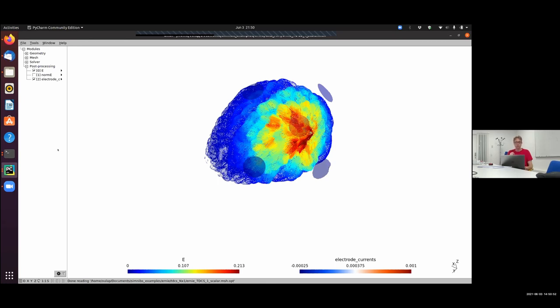Still, you can do that and just get some impression of, for example, how large an area is likely stimulated in a specific subject. But the way you choose the threshold at the moment is, I wouldn't say subjective, but there's a subjective choice component for sure in it. There are certain ranges where you know that when you're below, it's very unlikely that you stimulate. When you're above, it's quite clear that you stimulate, and you will probably have some gray zone in between where you make your subjective choice and say, well, that's probably a good threshold to work with at the moment.